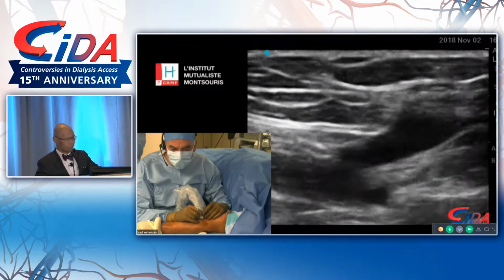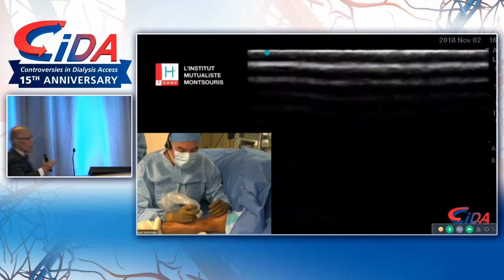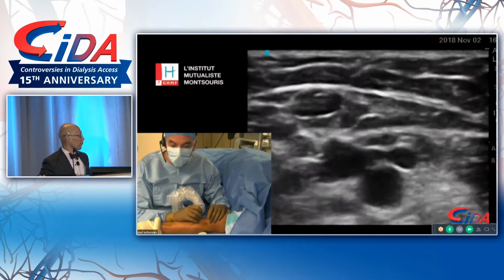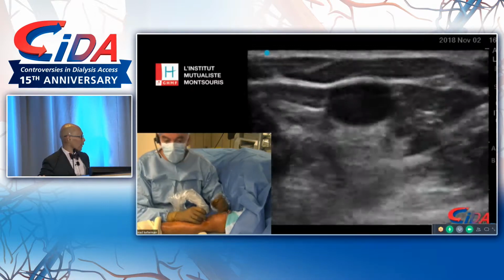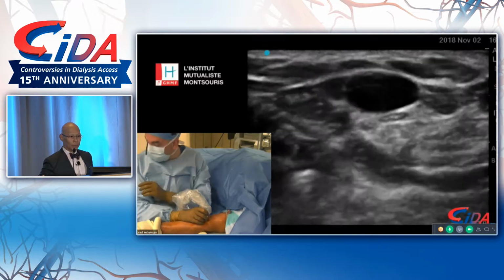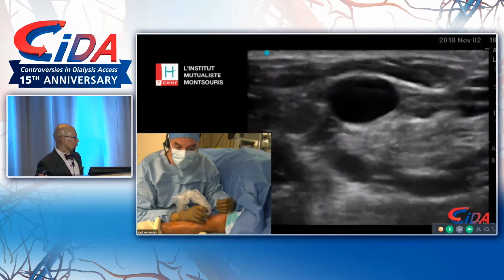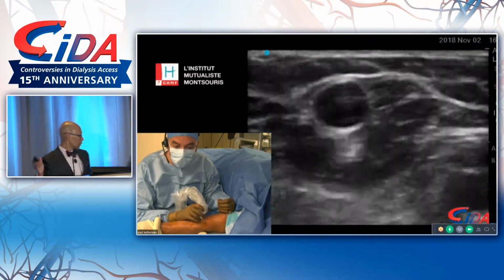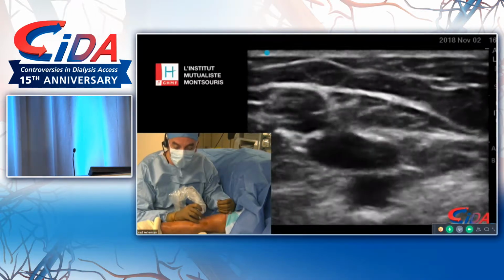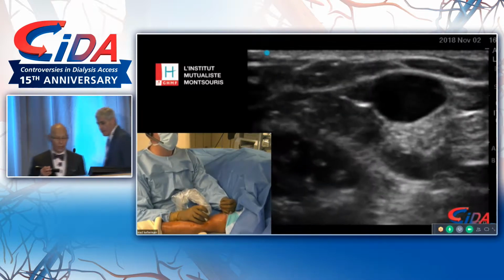Hey, Aris, is it feeding the basilic as well? We saw this. No, here we don't have a median basilic in this patient. You can just talk into him, what he's saying. Okay. Are you guys okay? Can we start the case? Yeah. Jeff, rock and roll. You're going to approach this through the median cephalic vein? There's no median cephalic vein in this patient. You just speak into the microphone. Okay, Aris, are you okay? Can I start the case? Yeah, you can start.